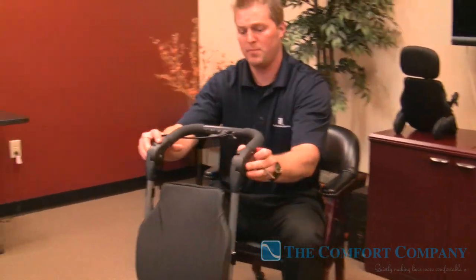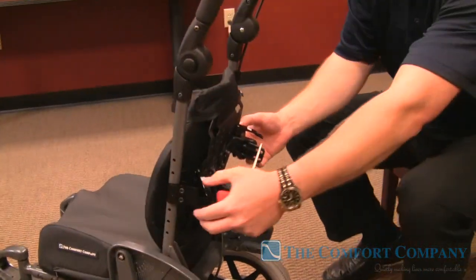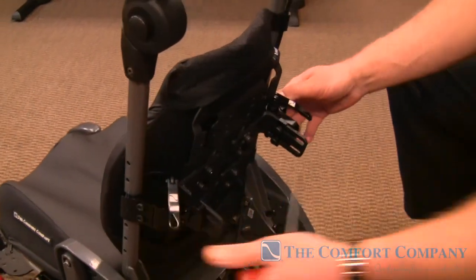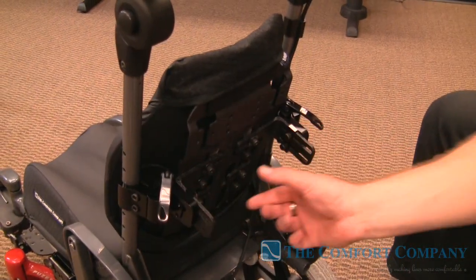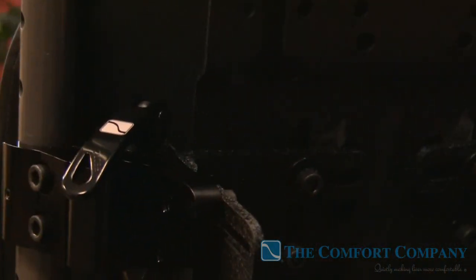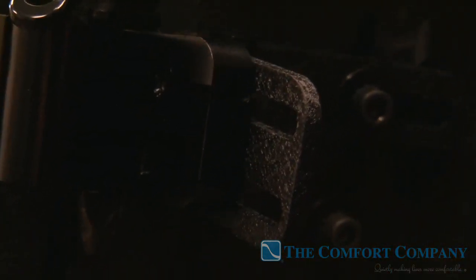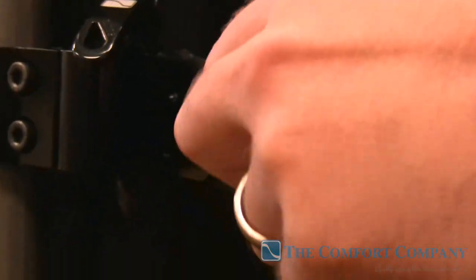There are a couple of safety features I want to show you on this compass hardware. When you have this single point of attachment, we've added cleats here. These cleats do a really good job of preventing any unwanted rotation in the back — so if you have a kid with really high tone, a head banger, or someone who's bending or breaking hardware through transfers or whatever, this is one safety feature. The other safety feature — a new addition to the compass hardware — is this little bolt right there.